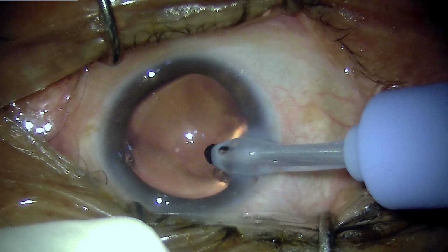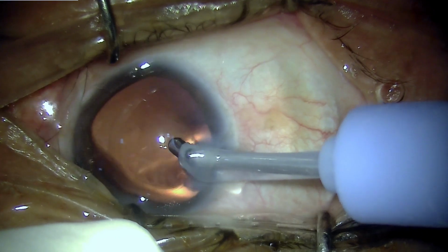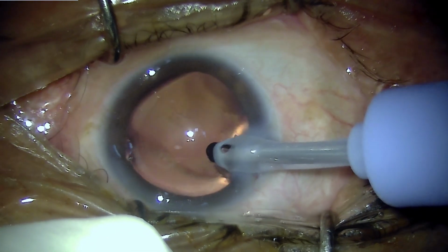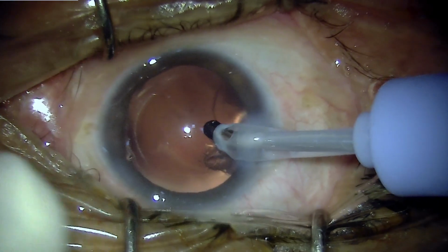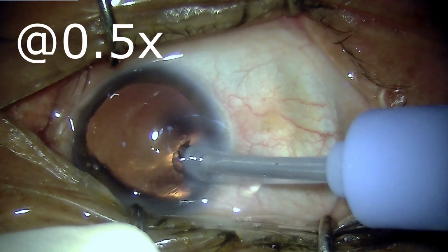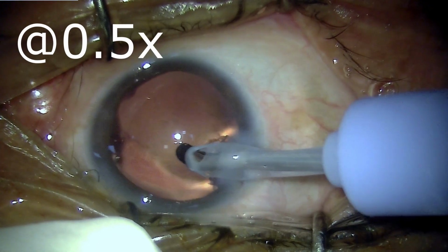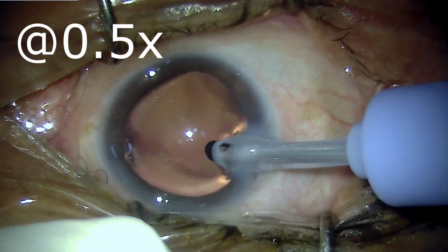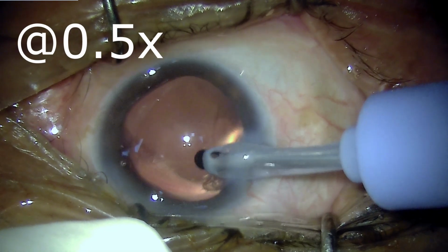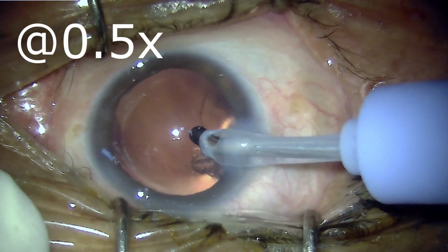So here we have a little collapse of the chamber and then the posterior capsule rupture. You'll see this in slow motion. At a point, the cannula was withdrawn too much, and at that moment, the irrigation ports came out, and there was a collapse of the chamber. The aspiration was on, so the PC was caught, and there was a PC rent. Now, this is a situation we want to avoid.